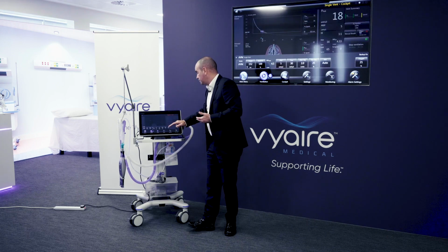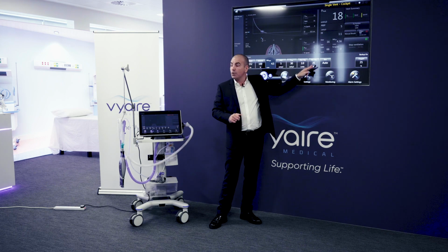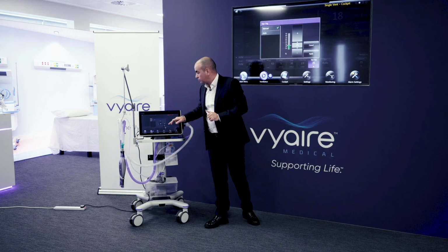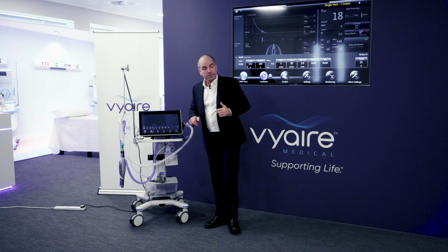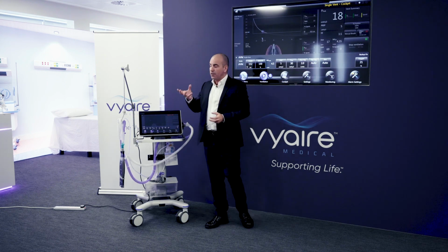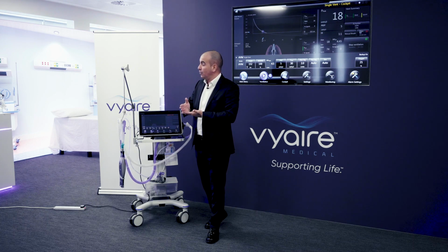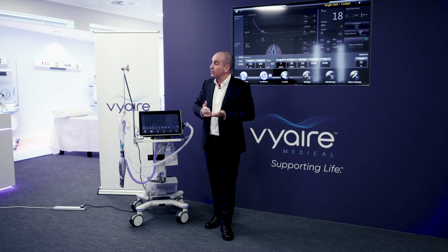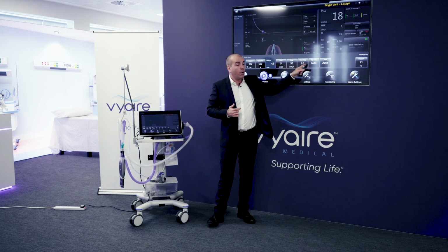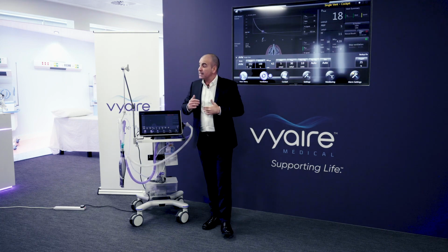So what we've done here, we have two features, auto rise, and we call this auto sync. The doctor can set it manually if they want, but we have a feature here to make it more comfortable for the patient. To turn the breath off, you can have it set manually, where the patient has to reach a certain timing threshold or a certain flow threshold, and they will struggle to breathe out until that threshold is met. If we automate it with auto sync, it synchronizes with the patient.